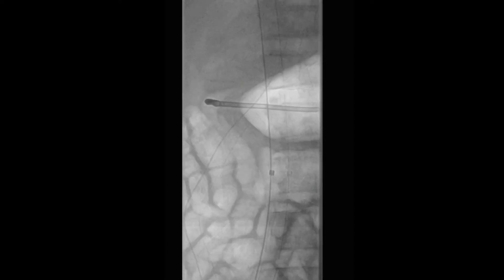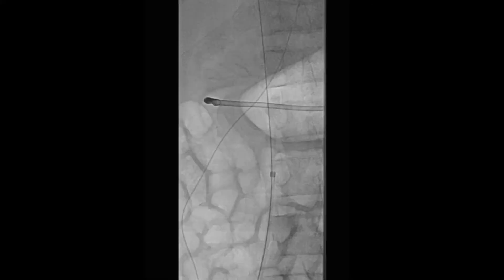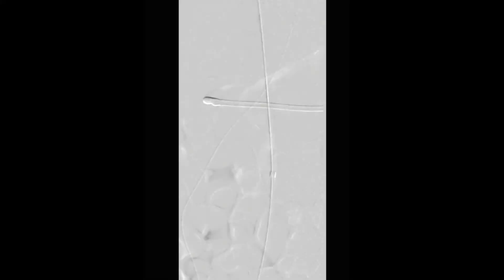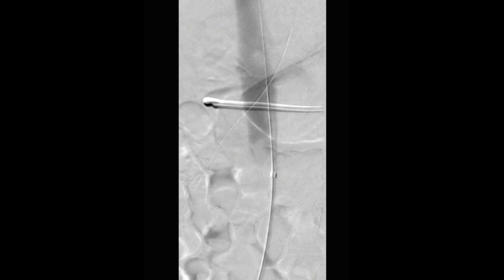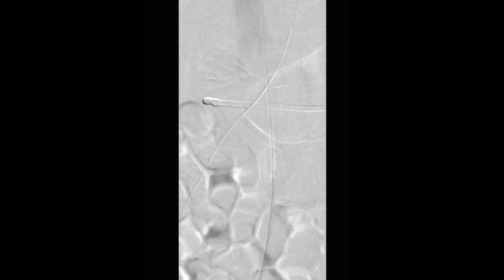This sheath is used to perform a venogram, which is done to better delineate anatomy. Demonstrated here is the venogram performed, which shows the lowest renal vein.